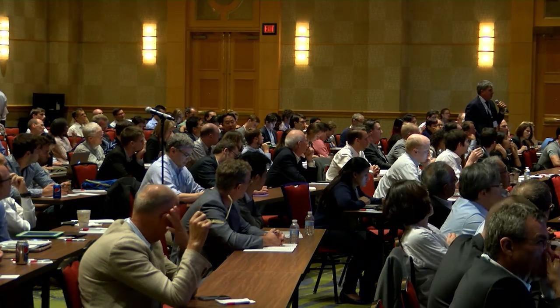Great presentation. I can understand that you can treat the deeper located lesions and the surgeon could agree with you. But how did you convince your surgeons to not resect the very superficial ones? Well, in that study, we have some superficial metastasis to treat, but the aim was not to treat such kind of liver metastasis, just to demonstrate that we can safely ablate them, and then we will try to ablate juxtavascular liver tumors, which are the main difficulty for surgeons.